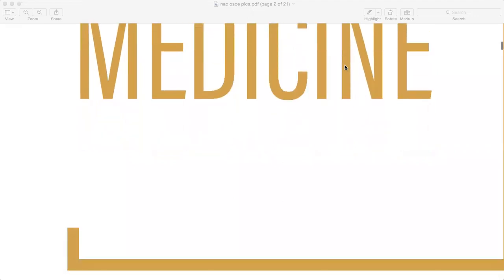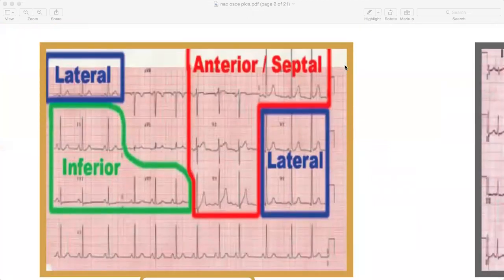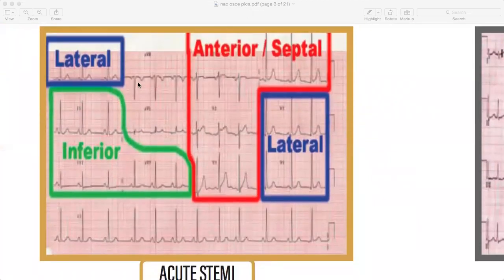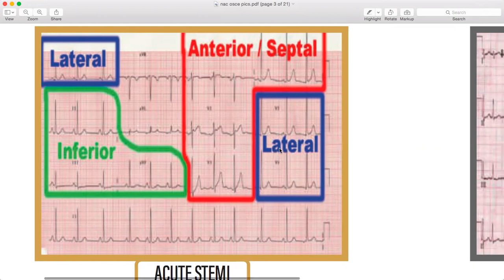Starting with acute STEMI — you need to know which leads correspond to which location: lateral, inferior, anterior septal. If it's V1, V2, V3, V4, it's anterior. If it's V5, V6, it's lateral. On the basis of the leads you identify it as an acute STEMI, and you need to write down which part — anterior, inferior, or lateral.